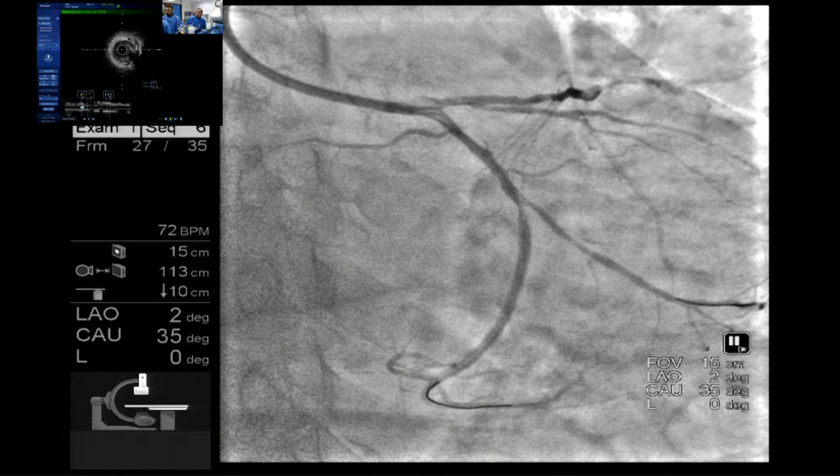And then measure the length. From distal dissection. No, just proximal. Here is a dissection. And then go into the bifurcation. Measure here, right from here. Okay, 10 millimeter, right? No. A little bit distal, I think. Much more distal. Right here. The best place to put the stent, right? And then go to the bifurcation right here. This is 20? 20. So I need a 24 stent. Okay, so I have some small protrusion and cover the distal.